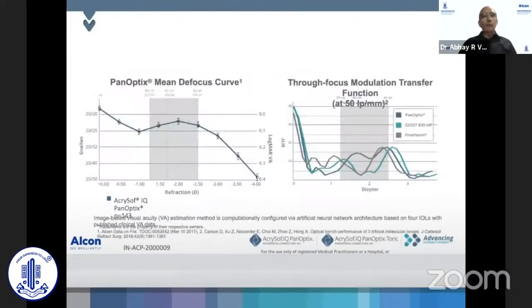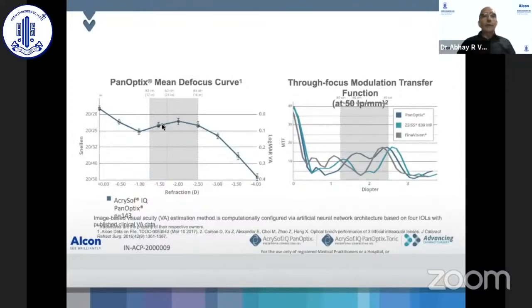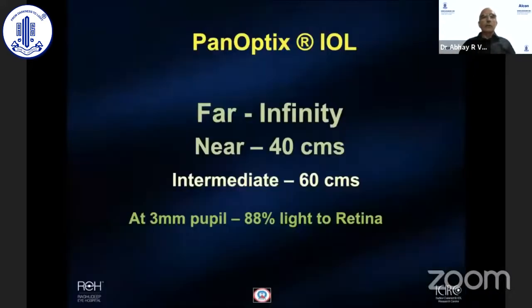And what it gives is this: if you see here, the defocus curve from minus, this 80 centimeter to 40 centimeter is more or less good quality, better than 20/25, 6/9 vision, in a kind of continuous range. It doesn't dip. When we compare it with these two other trifocals in that region, around 42 centimeter, both of them would actually have a gap here, which will go down in terms of visual performance, unlike this, which remains more or less in the same flattish curve. So that's the advantage in optical language and defocus curves.